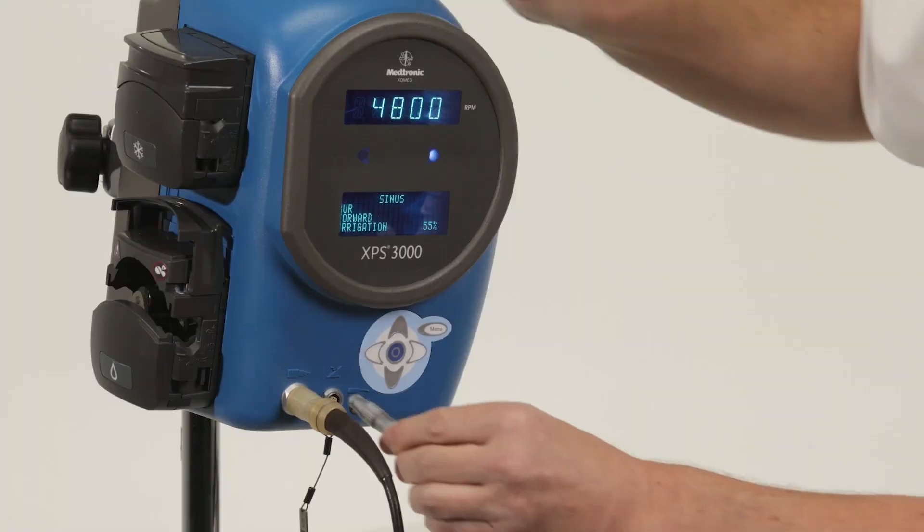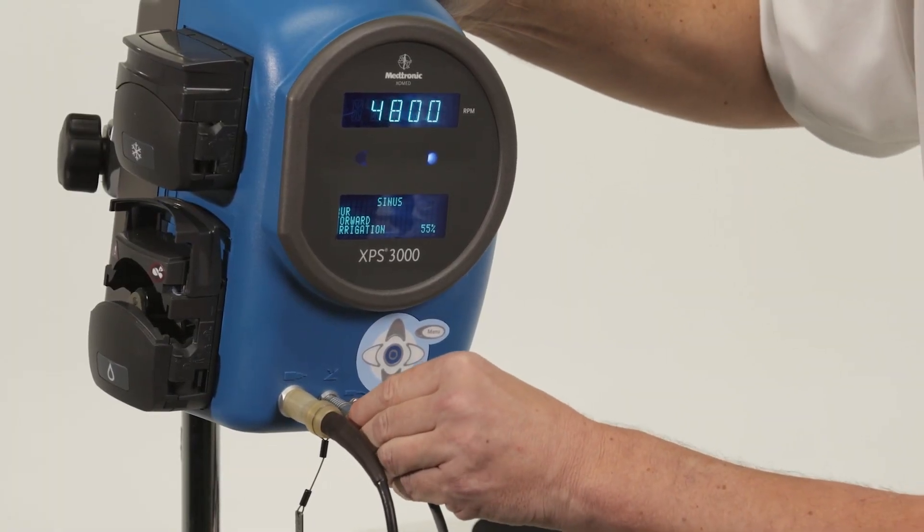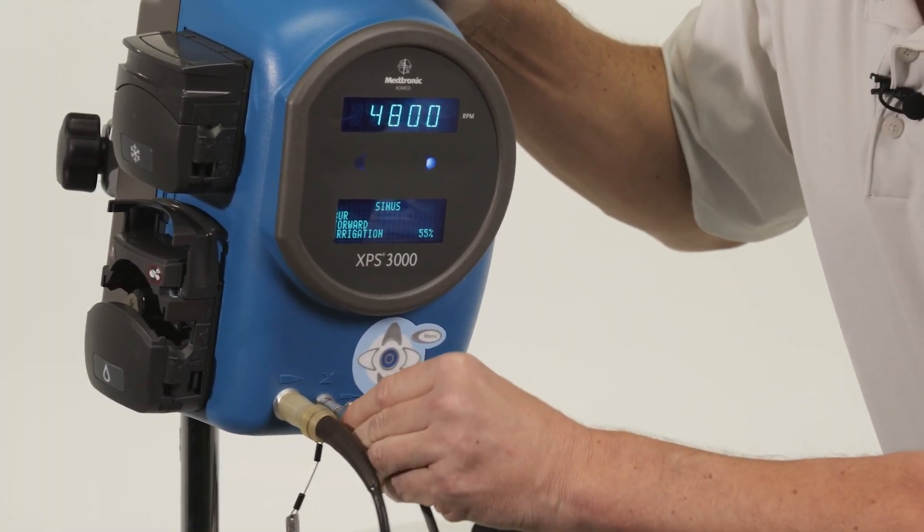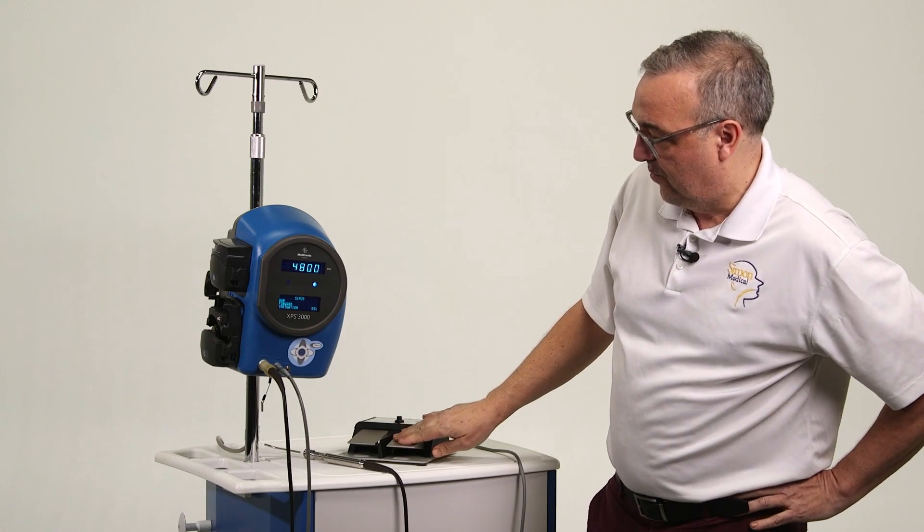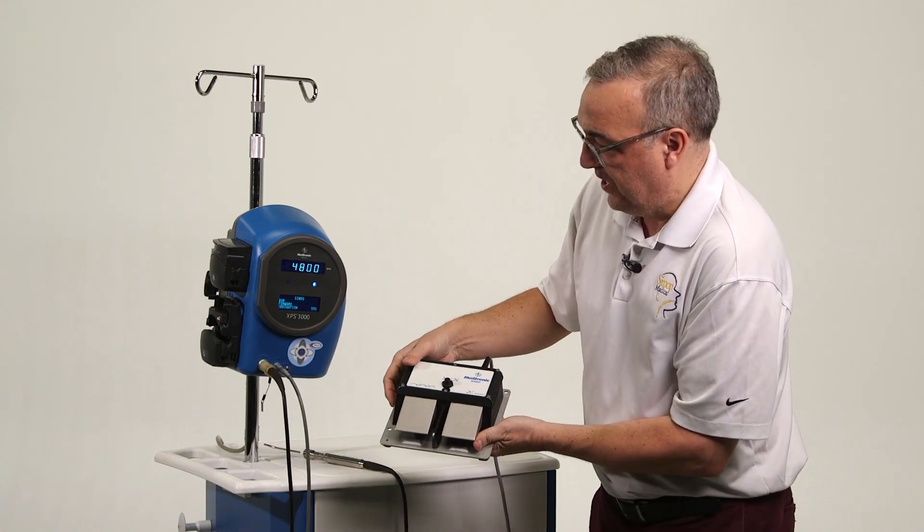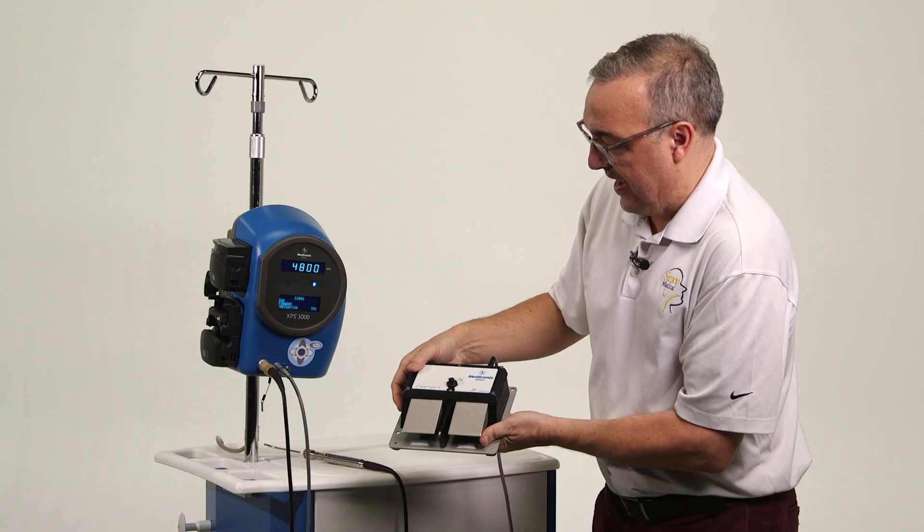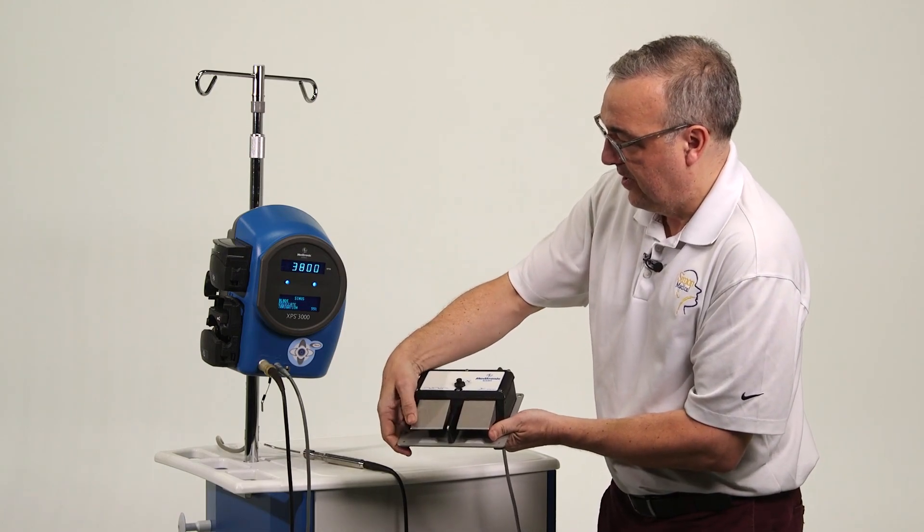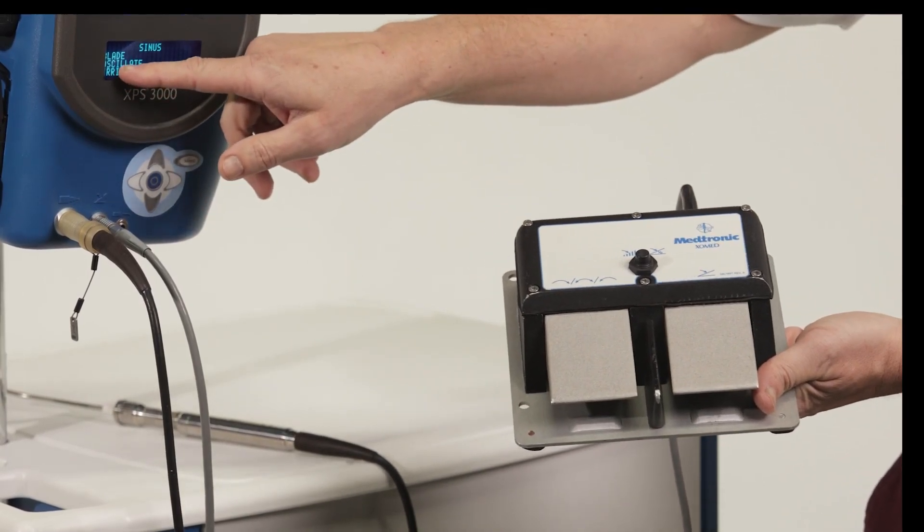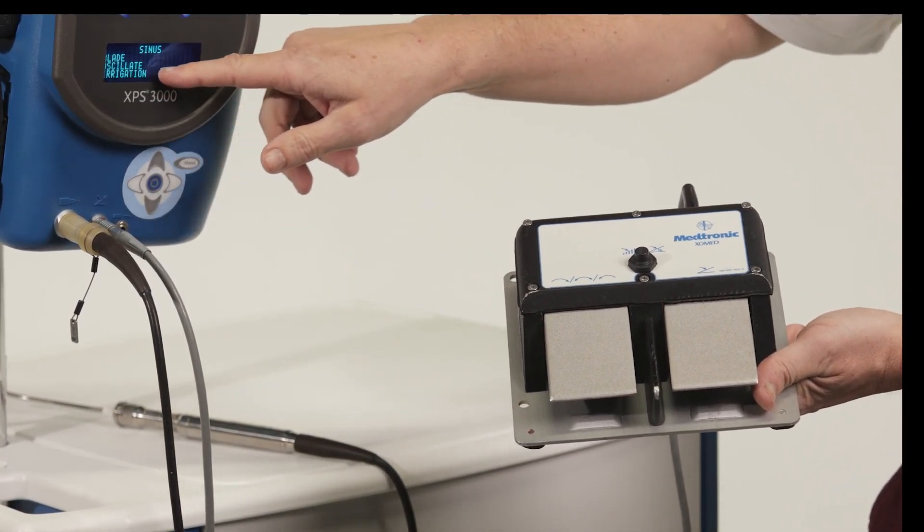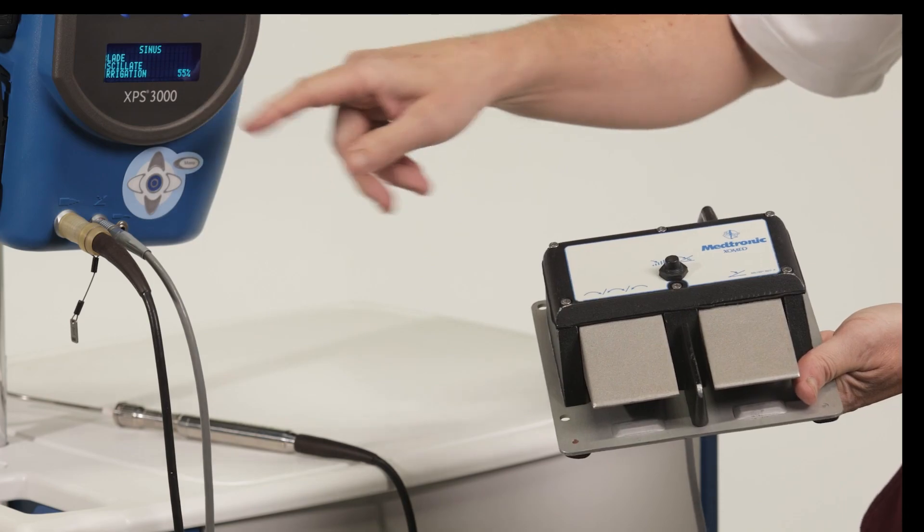Again, red dot up, especially if you're in a dark OR, it makes it much easier to try to plug this in. Now we've got the foot pedal controlled and we can actually do what we've done. If we want to change that from forward to oscillate, we simply press the left key, the left foot pedal, and we've changed from burr forward to oscillate for sinus blades.